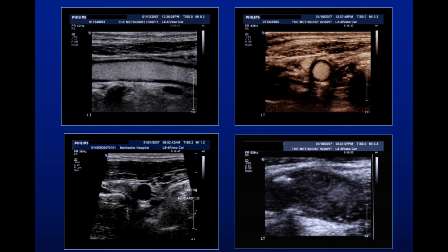the technology itself. There is some attenuation, some false positivity, particularly in the base, and I think at this stage it is not approved for clinical use, although we can use it because contrast is used for stress echo again. So we could use this technology. The other thing is taking a look at, here you go, use in the vasculature.